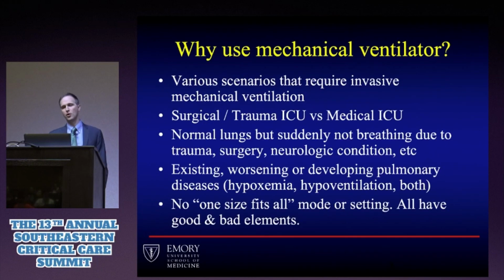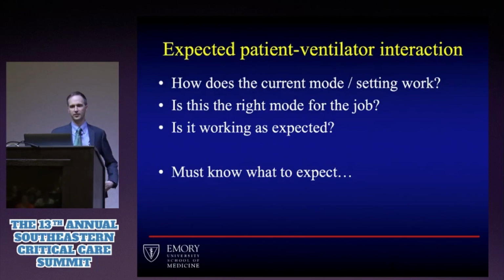So there is no magic answer for one mode or one setting that will be a cure-all for these patients. And so you have to know what you're expecting to do, know whether that's what's happening, and if not, identify what's wrong and how to address it. So first is identifying what you're expecting.